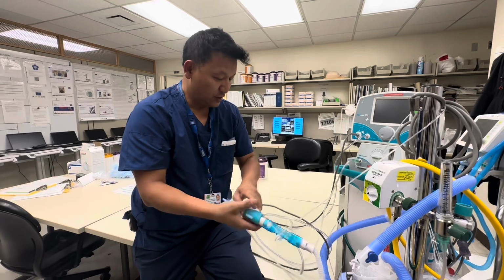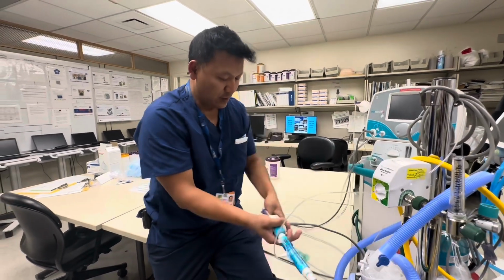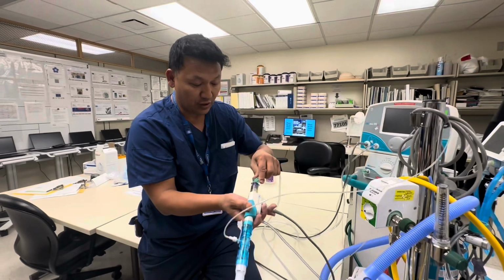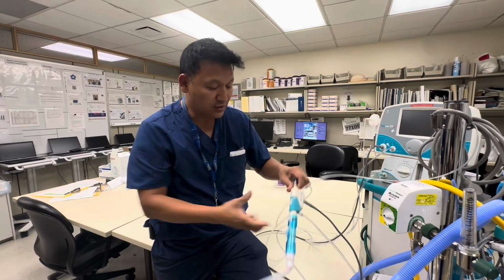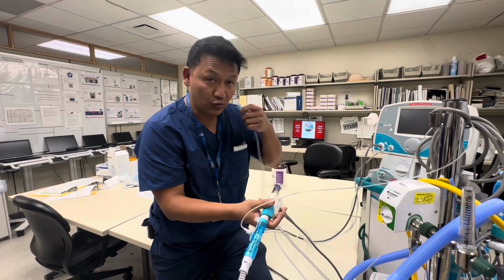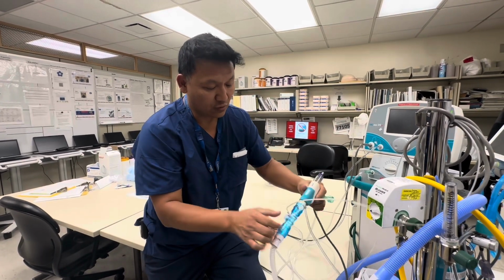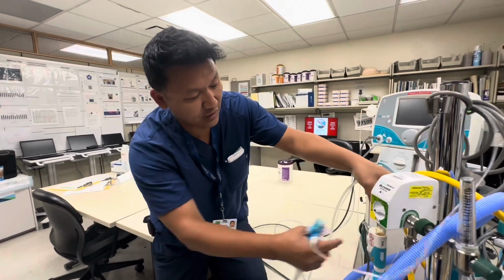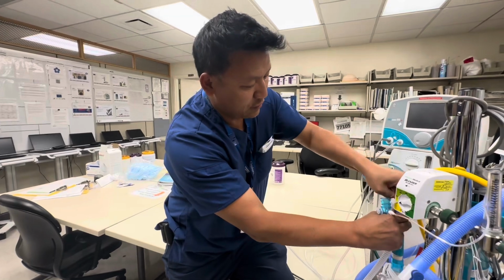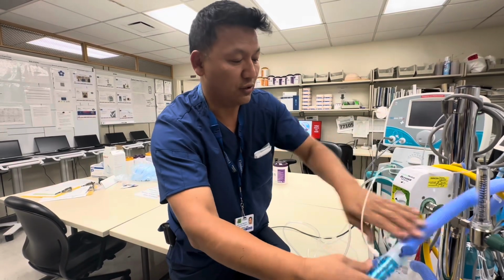The O2 was here, and then direct from the blender to here. The reason it wasn't working is because it was still reading 100% because this wasn't blending. So that's why we had to abort that technique, and then we had to use the blender. So it's the only way. So just letting you know.